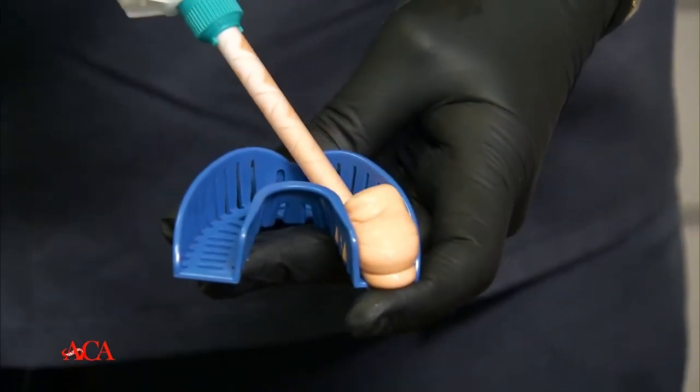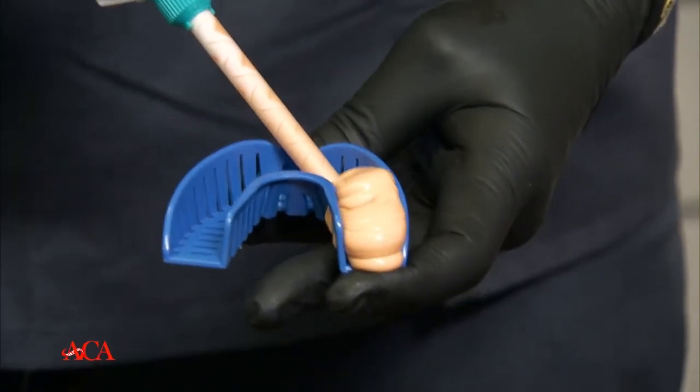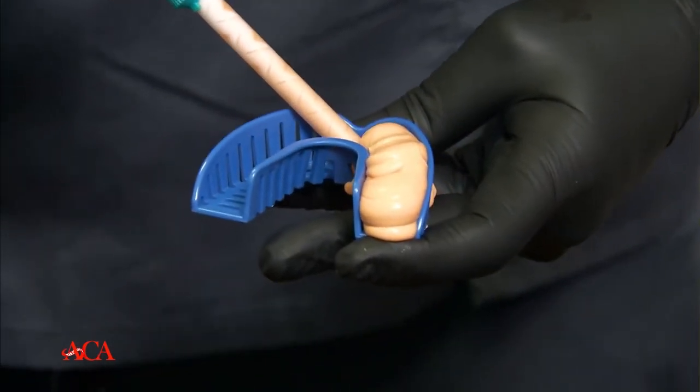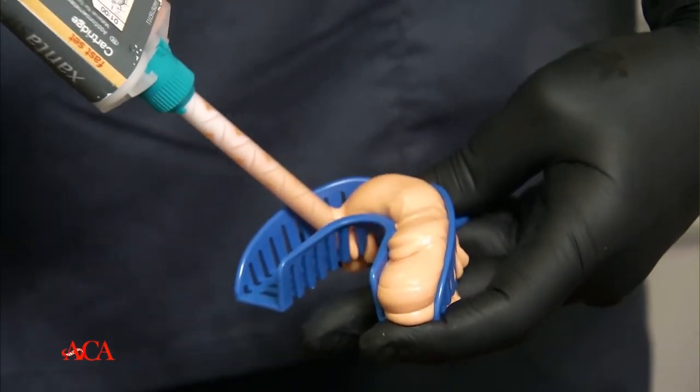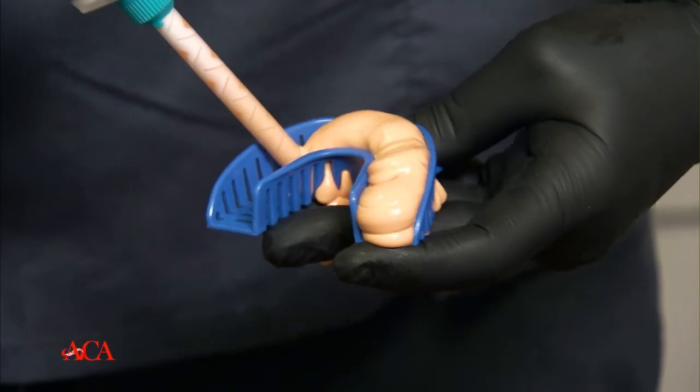And notice a couple of things. I'm not lifting my tip. I want to make sure that I keep this tip right into this material. I also want to make sure that I make enough of an area where we've got plenty coming through.